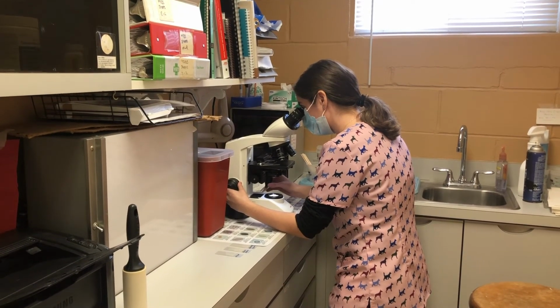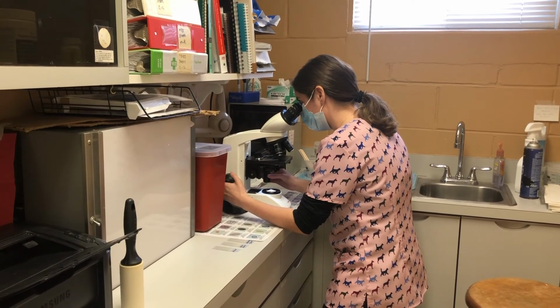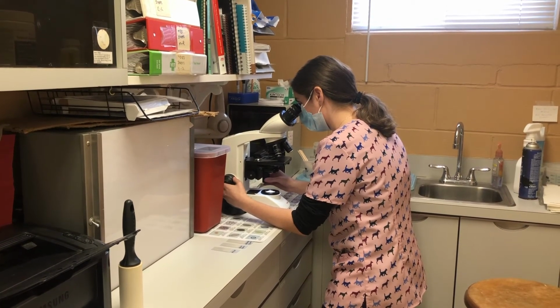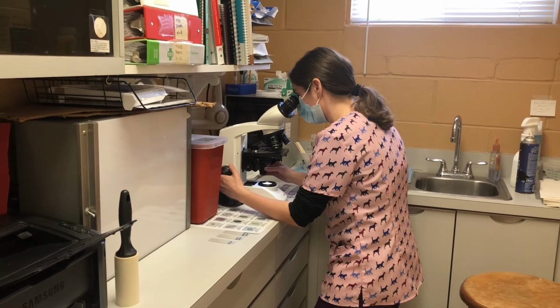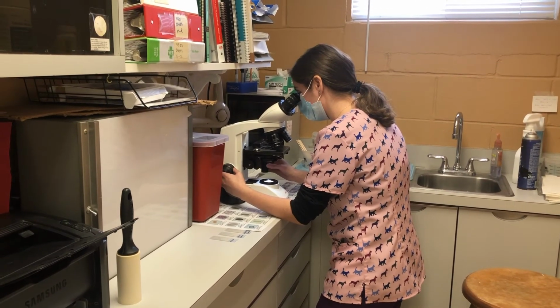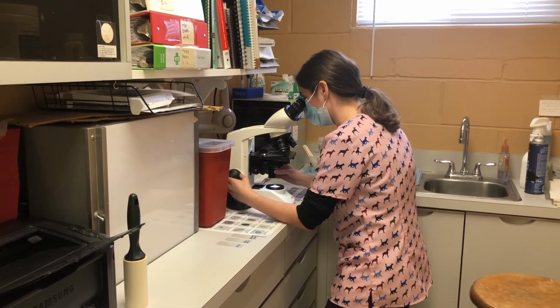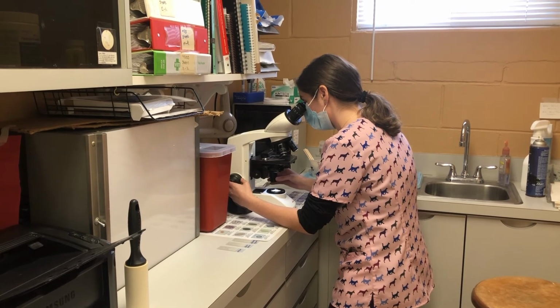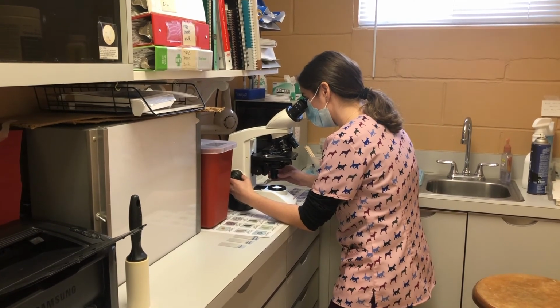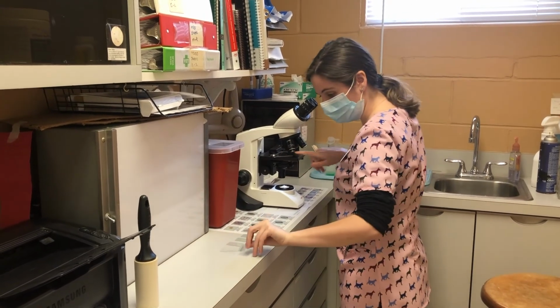And just looking at it, I can already see that there is some agglutination present here. They're all kind of clumped together in certain spots, almost like a clump of grapes. So this would indicate that this is not compatible with the recipient. But we'll take a look at the other one just to make sure. Okay. So that was our major.